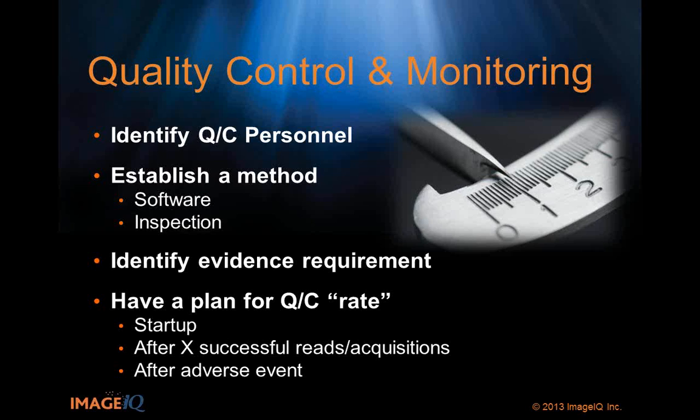Right. And really, as you're documenting all these things, the who is really important, right? Is it a technologist doing some QC before it goes? Is it a radiologist? Is it software? Who's doing it? So as you go down the list in your imaging protocol, you'll really want to answer the who, how often, when, things like that.